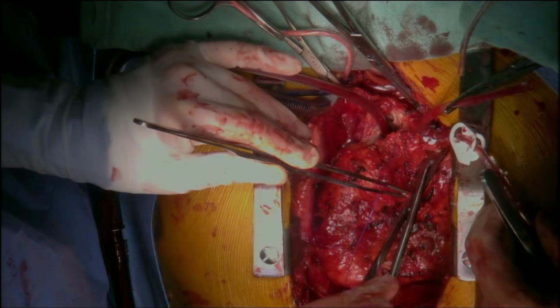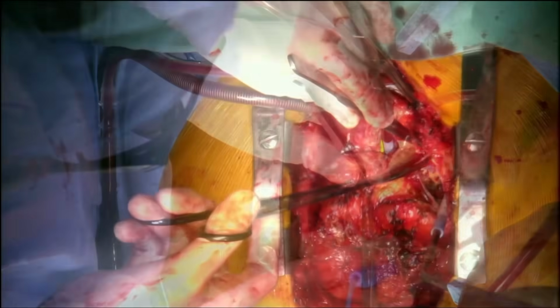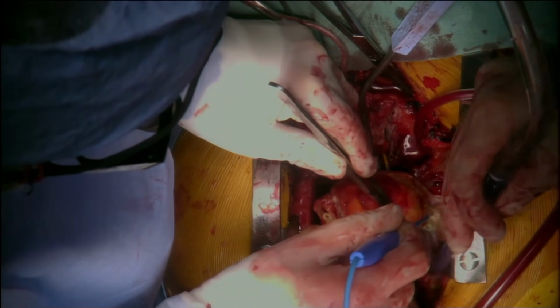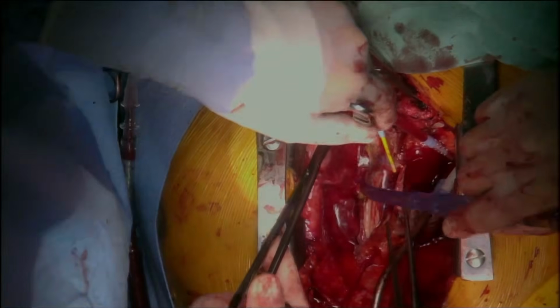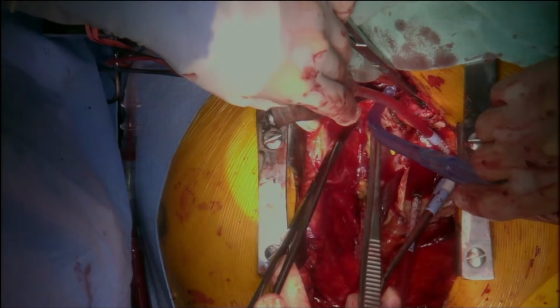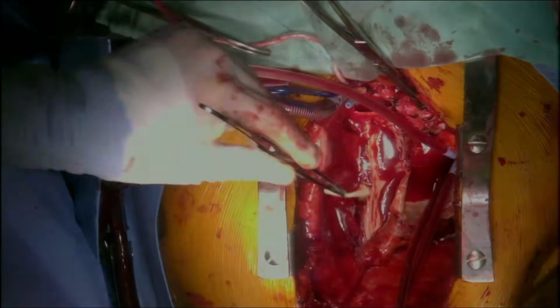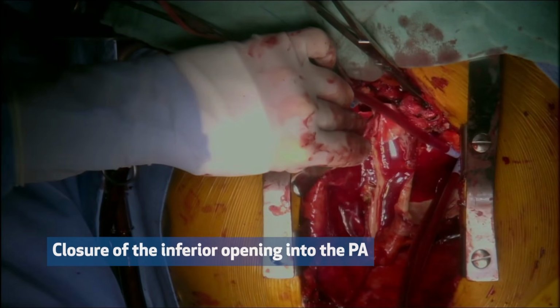The aorta was transected, the pulmonary artery was transected as well, and the heart was excised. The SVC was disconnected from the pulmonary artery, and the pulmonary artery was reconstructed using the heterologous pericardium.